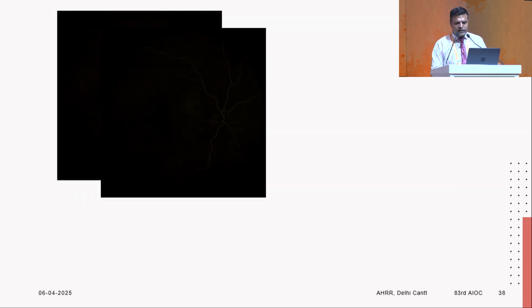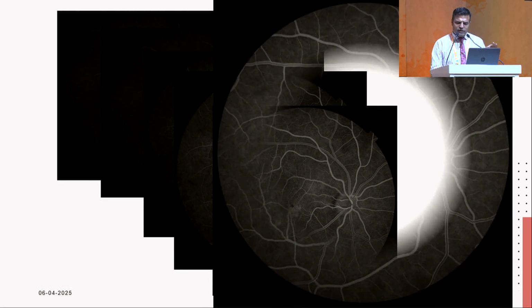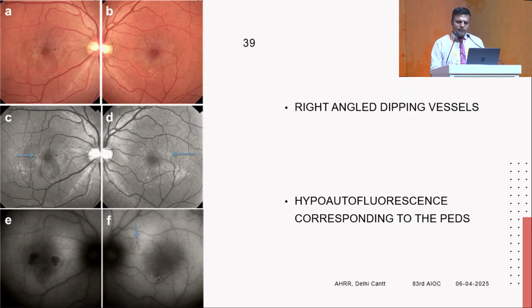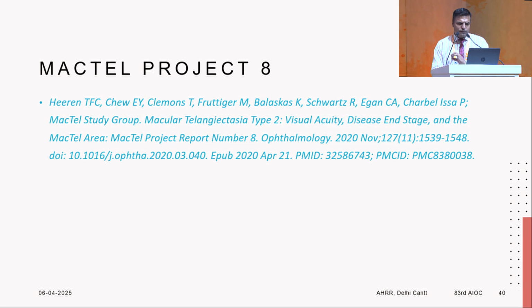Now this is what initially was our understanding of MACTEL, that we used to look at the fundus fluorescein angiography and wait for these fine hyperfluorescences to occur in the perifoveal region. But this was a slightly late way of picking up the disease. The books talk about looking for a right angle dipping vessel, but I will share this insight that in a busy OPD, it is pretty difficult to look for such a case if you are dealing with 100 to 150 patients a day. So one should look for multimodal imaging, and autofluorescence, OCT and OCTA come to our rescue.